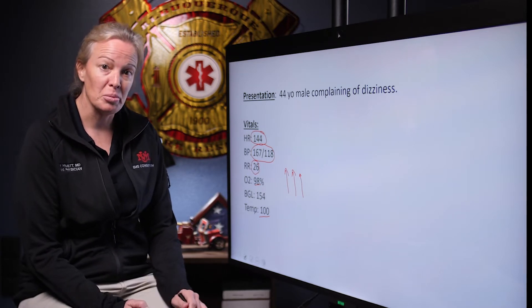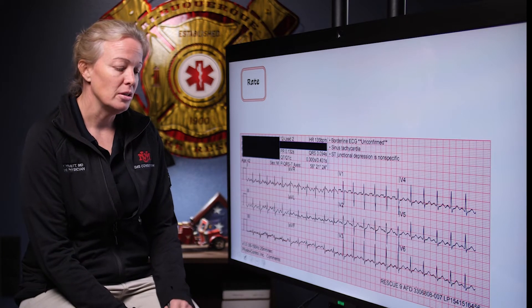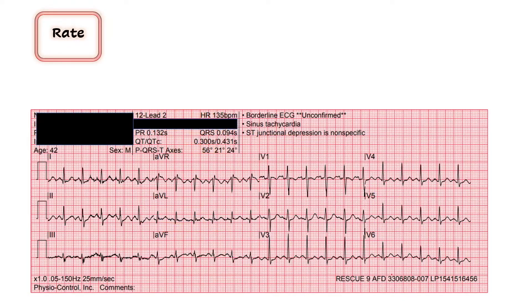With any complaint of dizziness, we'll get our 12-lead within the first five minutes. We start and interpret these the same way every time, beginning with rate. The computer says 135. Doing a quick eyeball estimation of QRS complex distances, he is somewhere between 100 and 150, closer to 150, which is consistent with a rate of 135.